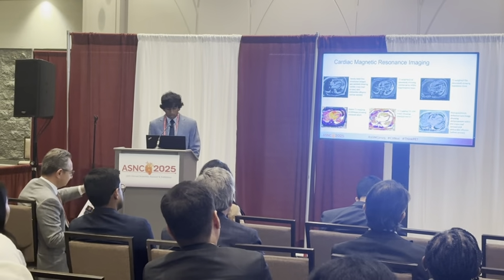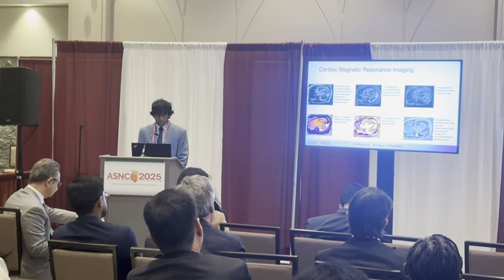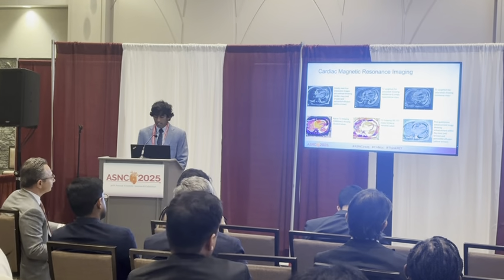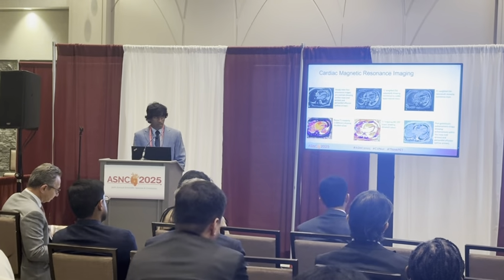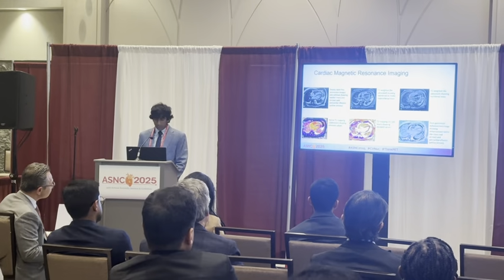The two images on the bottom left are native T1 mapping and T2 mapping images, both showing elevated values. The final image on the bottom right is a post-gadolinium enhancement image, showing enhancement within the mass with the red arrows and pericardial effusion, again with the yellow arrows.